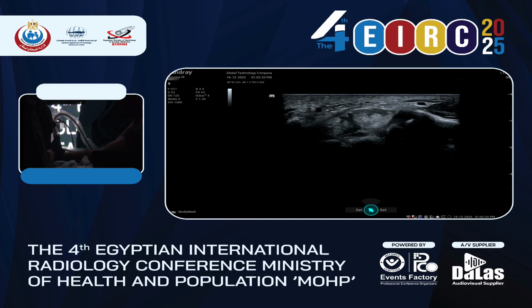and if I tilt a little bit, they become bright again. If someone is not sure what is a tendon and what is a nerve, you need to remember that the tendons are very much affected by anisotropy, whereas the nerves are less affected by anisotropy. And the reason is that the tendons are very packed with collagen fibers, so they have a lot of surfaces to reflect the sound, whereas the nerves are less packed and they have less surfaces.